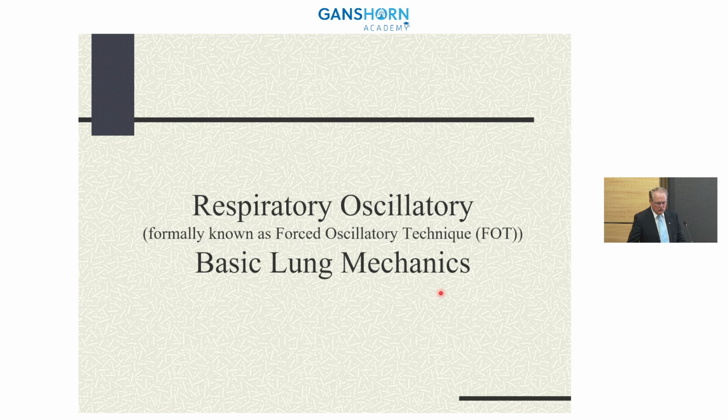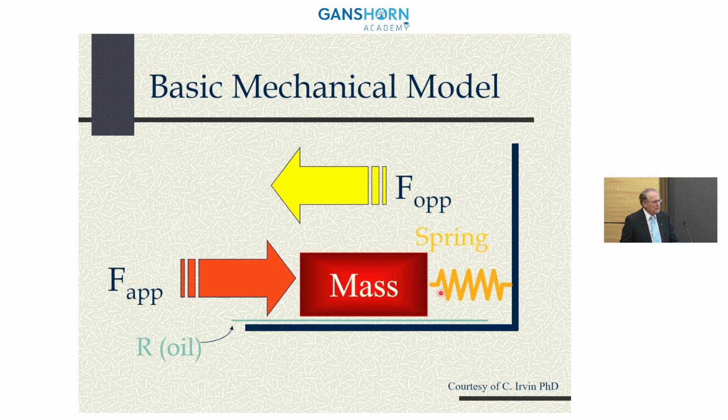We are now describing it simply as respiratory oscillometry because it does not require any forced effort by the individual. All they do is breathe tidally through the instrument, and the instrument itself creates the dynamic responses that we're looking for.